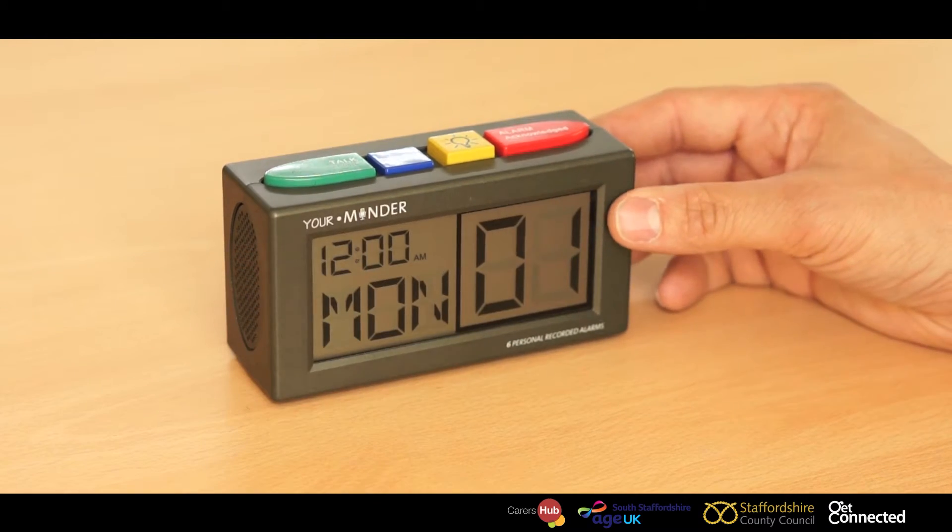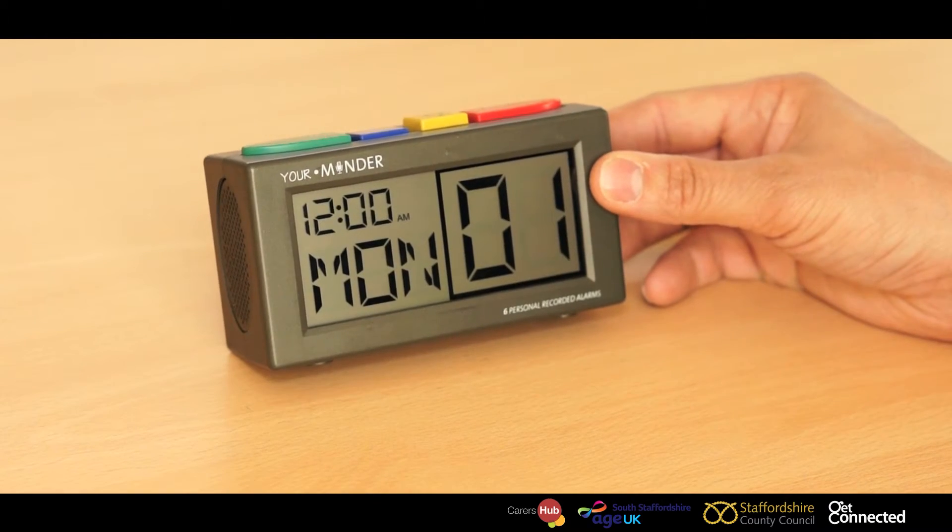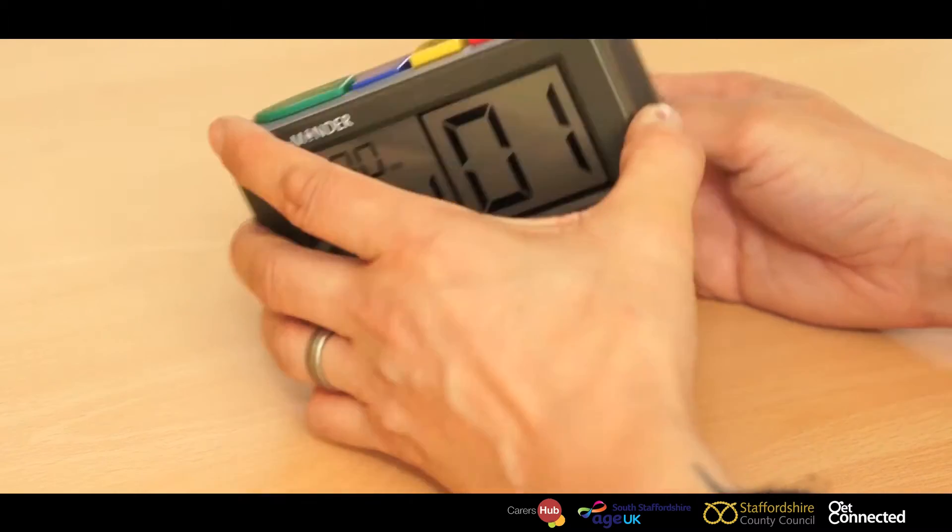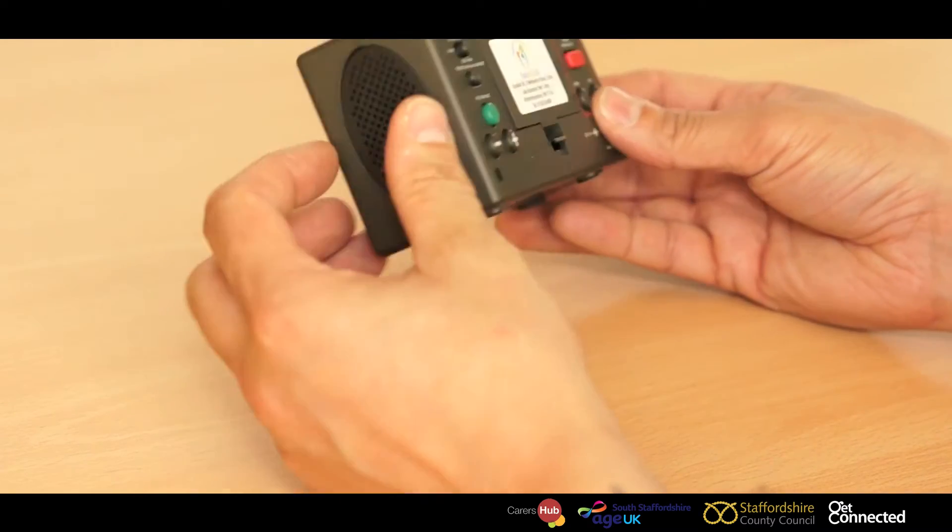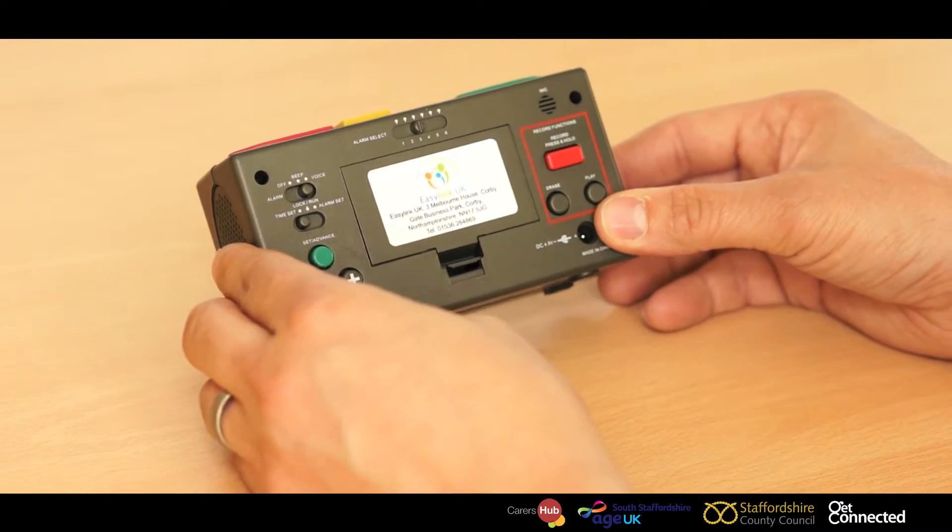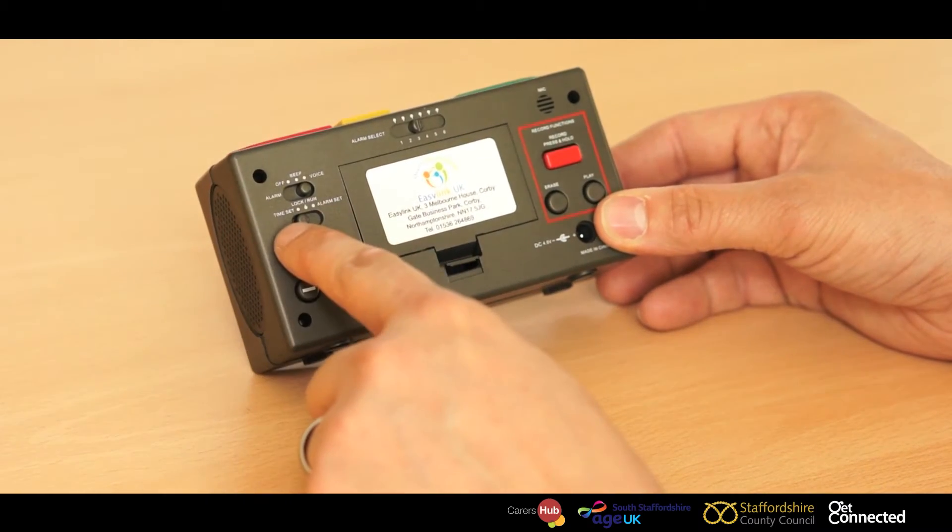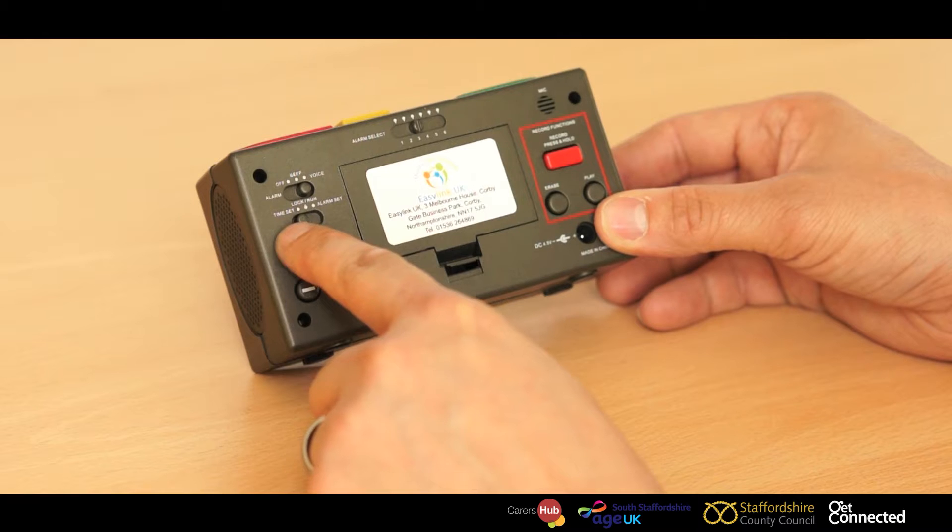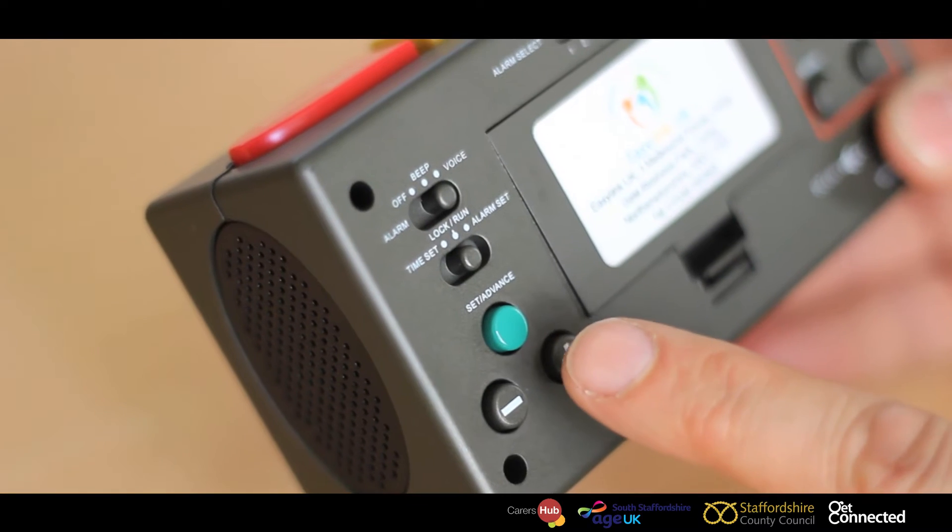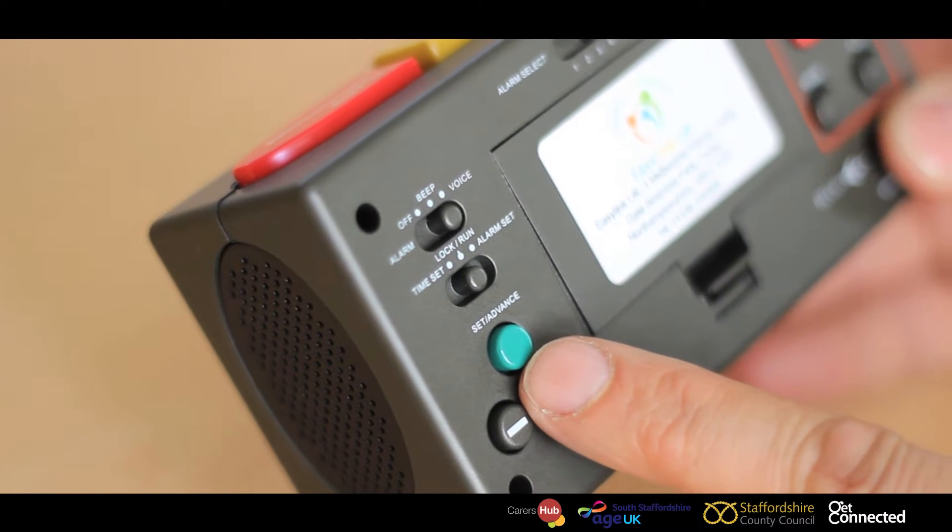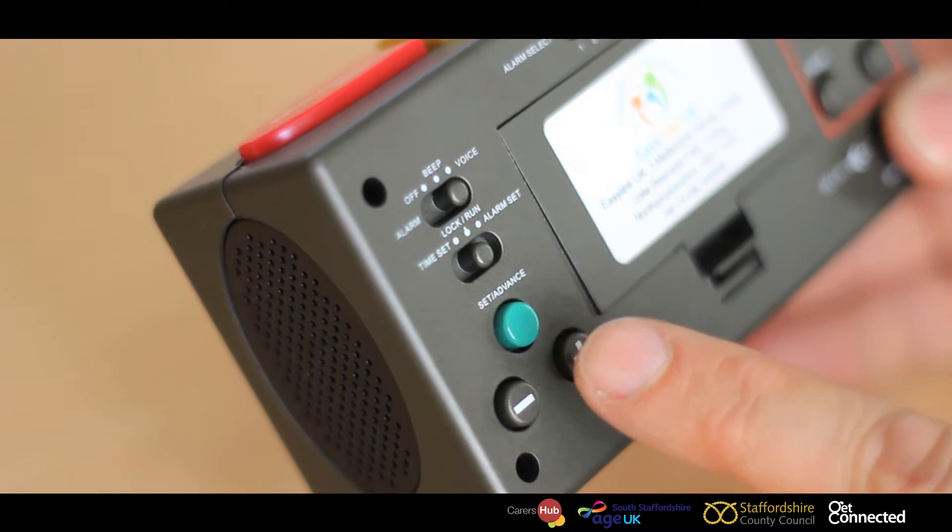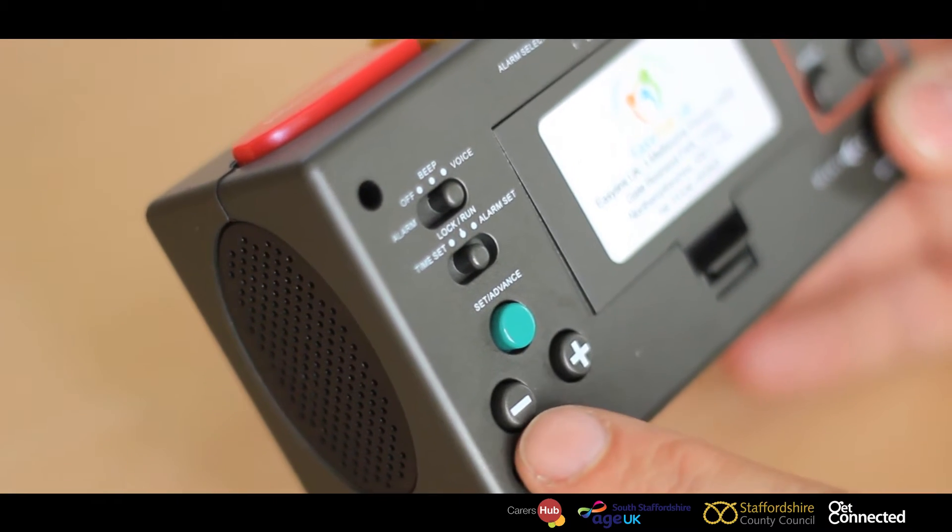We're now going to set the time. If you turn the your minder round, there is a set time on the back. We just flick that switch to set time and use the set and advance button to advance your minutes and hours.